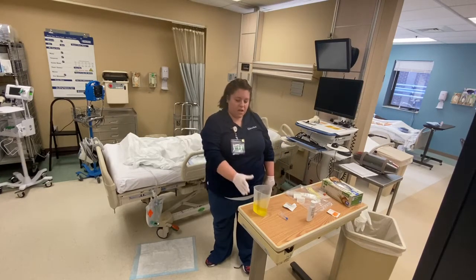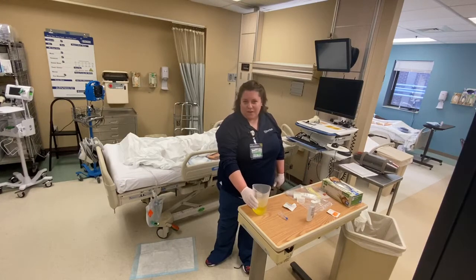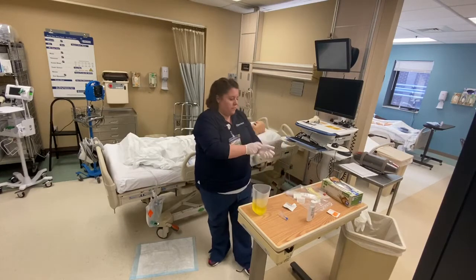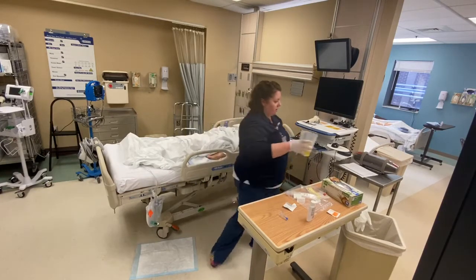Then when I'm finished, I'm going to take this, dump it in the toilet, and I will throw this canister away because it's one-time use only. Okay, so I'll do that.